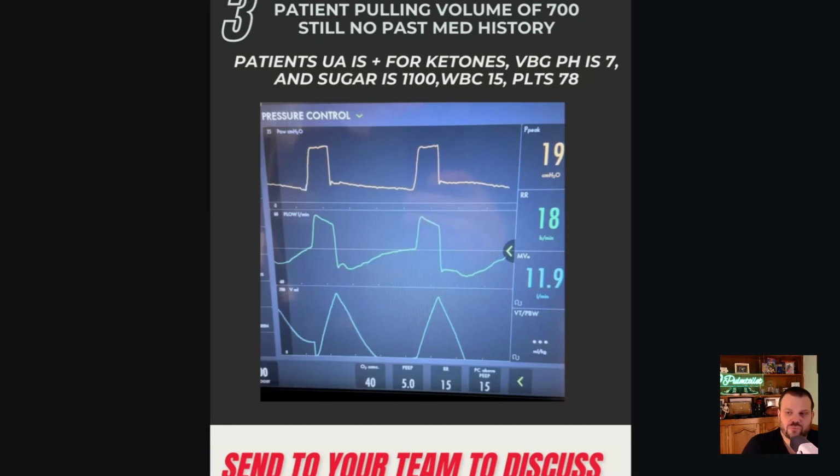breathing. So remember, the difference between pressure control and pressure support is not really that much, or not as much as you would think. Certainly in pressure support, we don't set a baseline rate, whereas in pressure control, we do. But besides that, and besides the cycling mechanism, pressure control is time, and pressure support, it's percent decay and flow. Besides those 2 points, there's really not a big difference between pressure control and pressure support, right? You have a PEEP, you set an inspiratory pressure, you set a percent FiO2, and that's basically it.